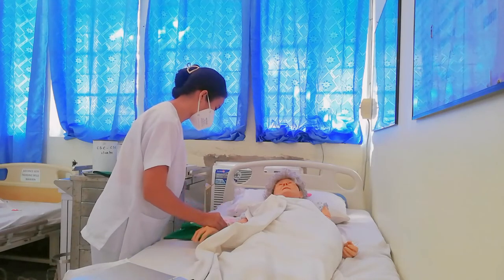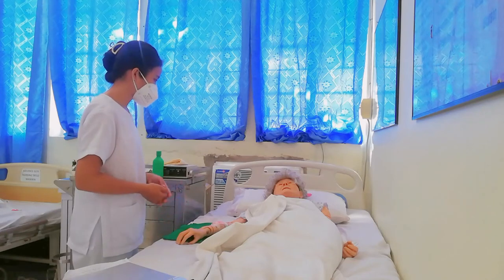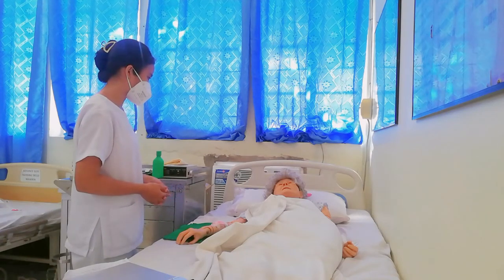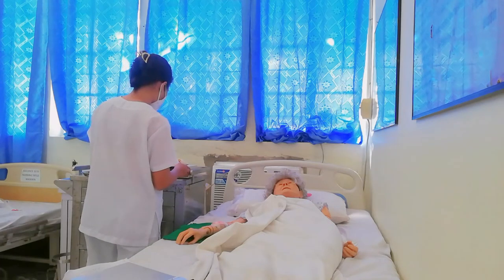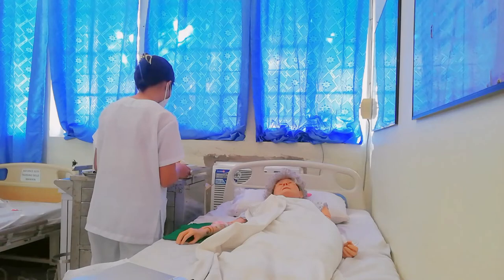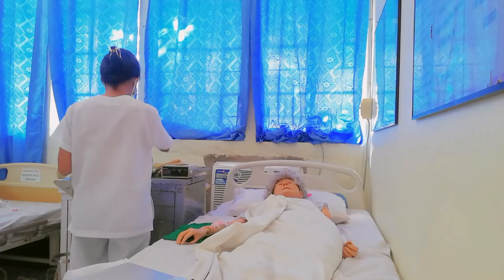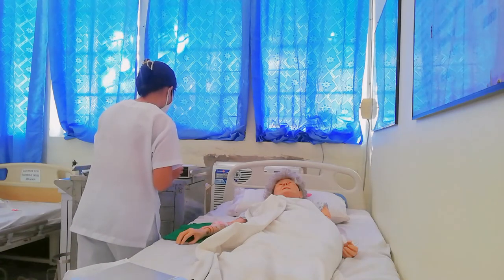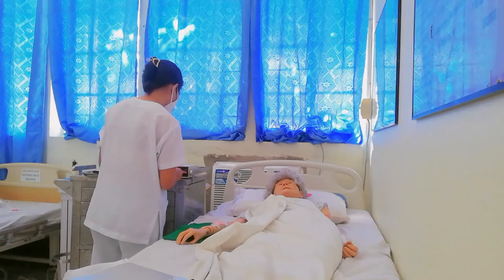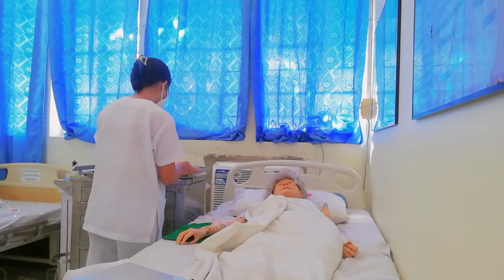Tell me if you feel anything. Are you comfortable, ma'am, with your position? I'm going to check that the water is at an appropriate level. I'm going to fill the control unit two-thirds full with distilled water. Then I will check the temperature setting to ensure that it is in the safe range, check for any leaks, and tilt the unit in several directions.